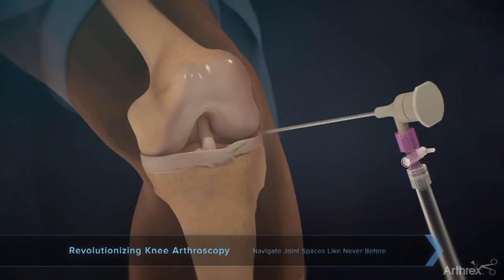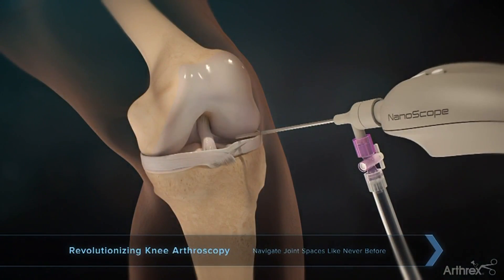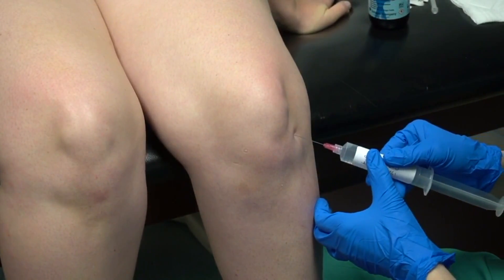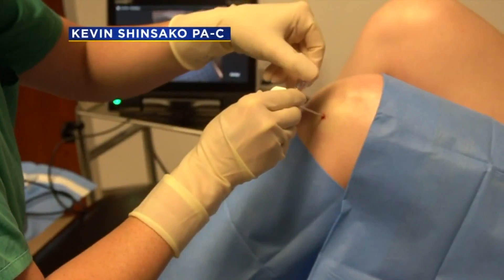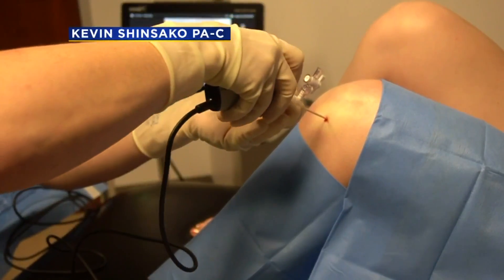It's quite a simple procedure. The nanoscope is minimally invasive technology, half the size of a traditional arthroscope. With Megan awake, Dr. Frank injected a numbing solution in her knee, and without making an incision, the tiny camera was inserted. Both could see the problem on a monitor.